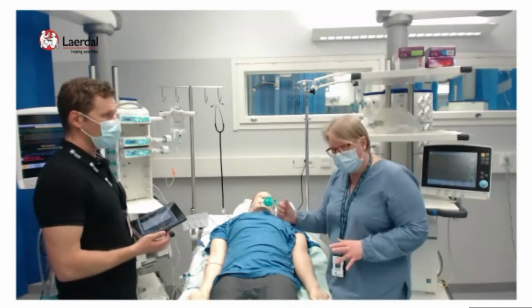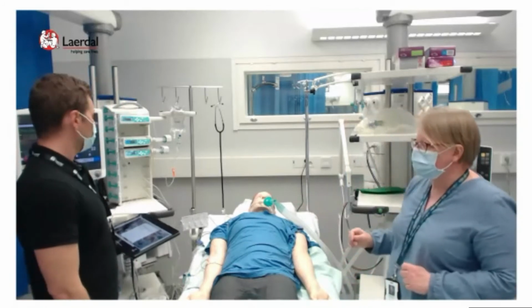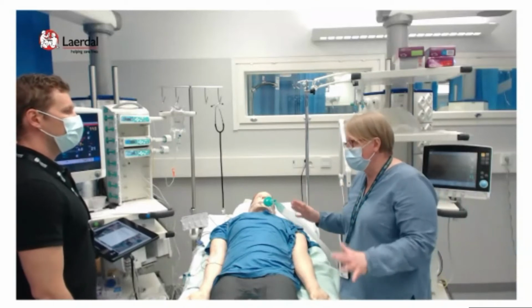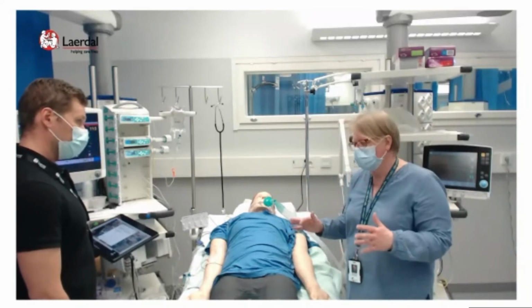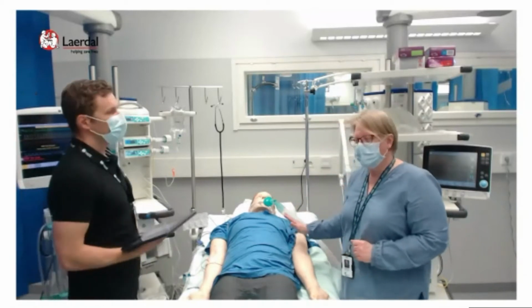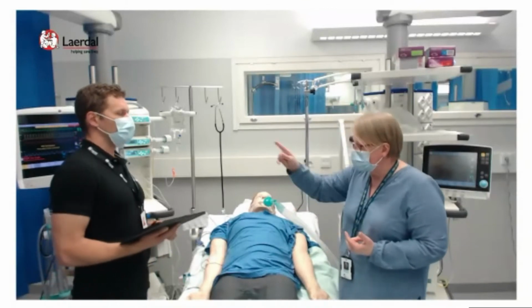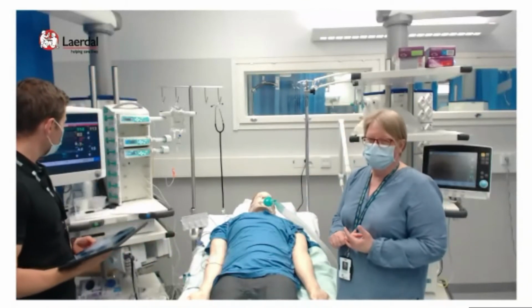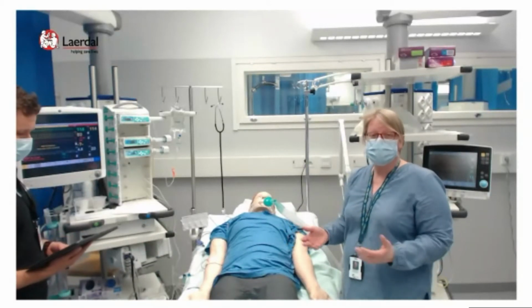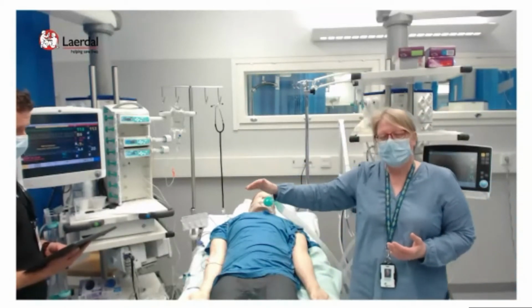And with these medications and the FiO2 rise, the patient calms down. The spontaneous breathing goes away. He's again very calm. But we have a problem with oxygenation. The saturation is not going up. So what's the problem? We ask our participants: why is the oxygen going down?